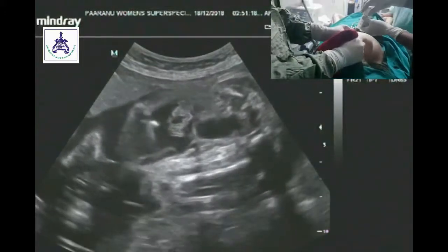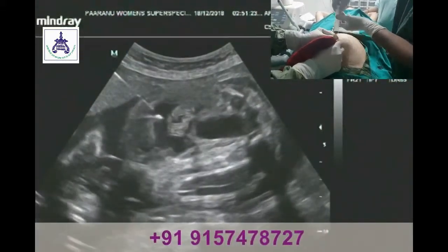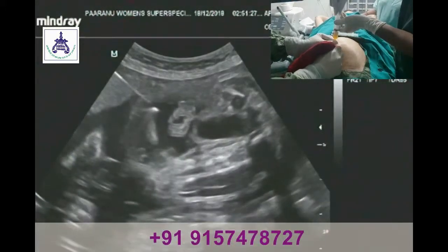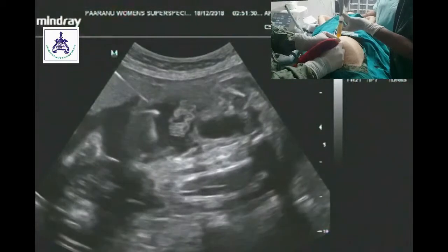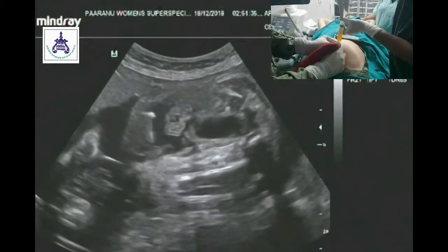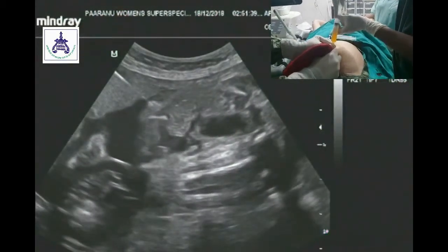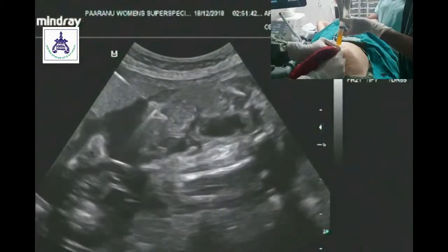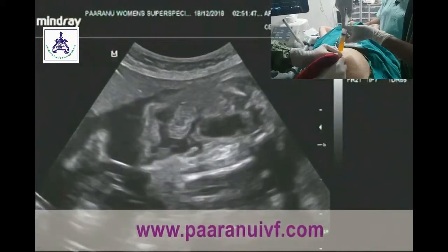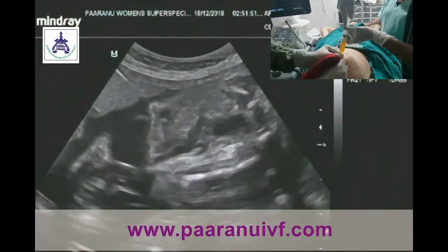Again we are attaching the syringe to the needle. You can see clearly in the ultrasound image that the abdominal ascites is gradually reducing and the other abdominal viscera are gradually settling down. You can see that around 20 ml of fluid we have aspirated again. So till now around 60 to 70 ml of fluid we have aspirated, and the image clearly shows that the ascites has gradually come down much more.